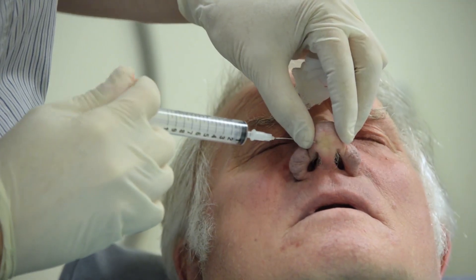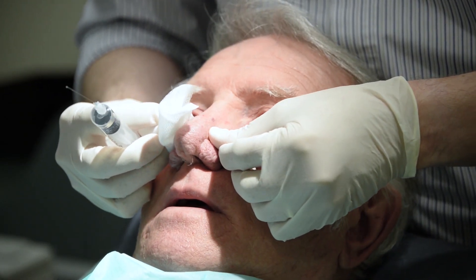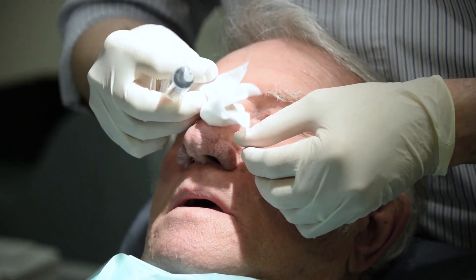Finally, the nasal ring block is completed by infiltration from the right to the left alar base, caudal to the nasal spine.